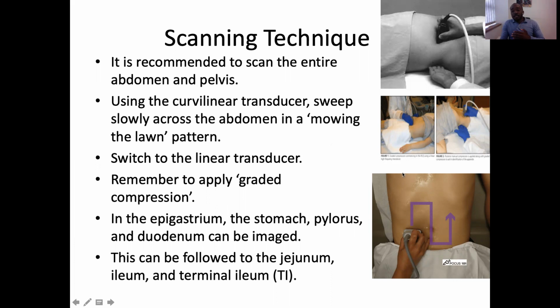Just have a good look at the entire bowel by mowing the lawn, just like that. Just follow it that way. Or you come from reverse, so from the sigmoid colon. I normally start from the sigmoid colon and just mow the lawn backwards that way, and just go slowly. Check for any abnormal bowel wall thickness, any area of hypo- or hyperperistalsis, any lump, mass, bowel dilatation, luminal dilatation, narrowing, and things like that.